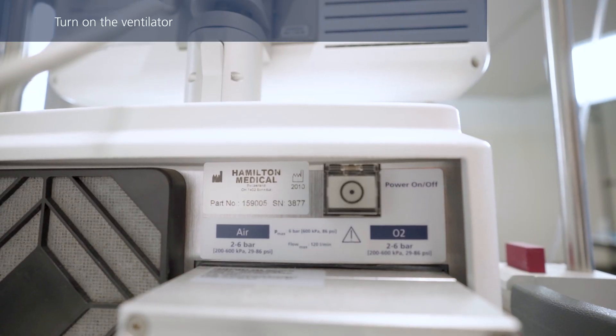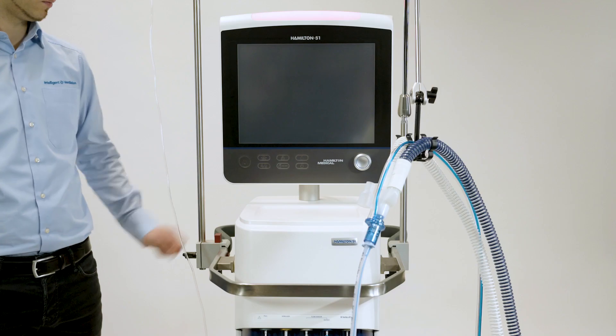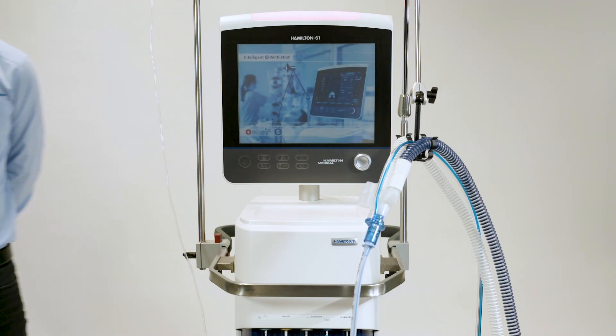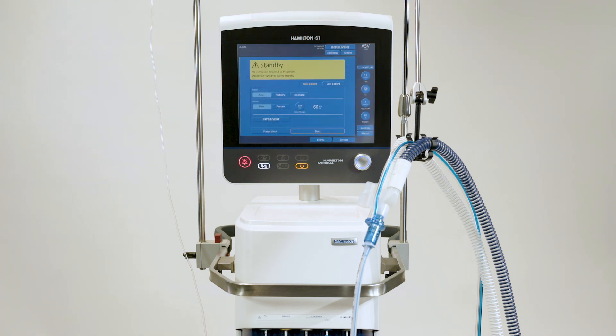To turn the ventilator on, press the power button at the back. The ventilator runs a self-test. When that is complete, select the correct patient group.